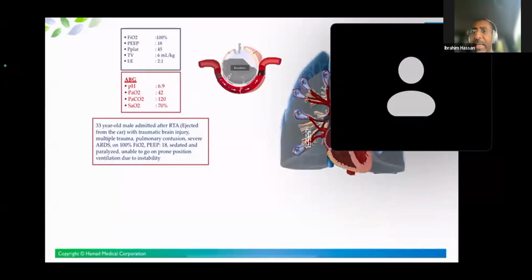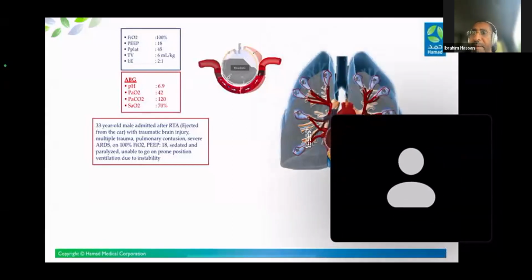And the next step after that, just to go back to the same patient that we discussed, you can see from the screen the alveolar unit that have a shunt, remarkable shunt. And this particular patient that we discussed earlier, very high setting in the ventilation, PO2 of 42, SAT of 70, white-out lung, it's a severe consolidation.